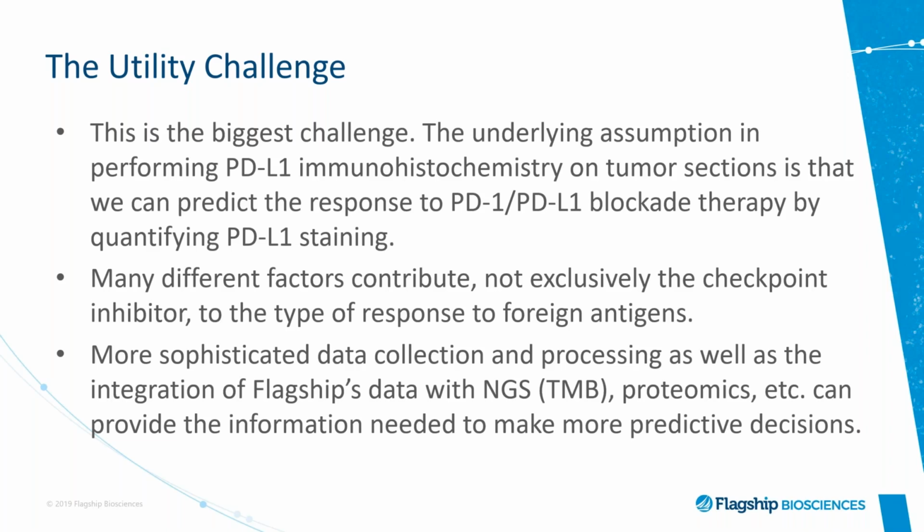In reality, many different factors contribute, not exclusively the checkpoint inhibitor, to the type of response to foreign antigens, including tumor antigens. More sophisticated data collection and processing, as well as the integration of flagship data with next-generation sequencing to calculate the tumor mutation burden, proteomics, and other modalities, may provide the information needed to improve the predictive value of the test.